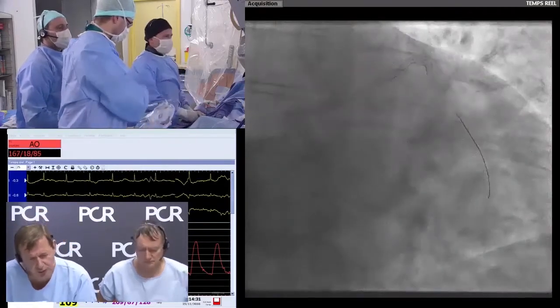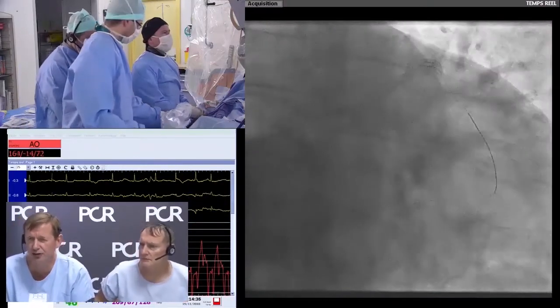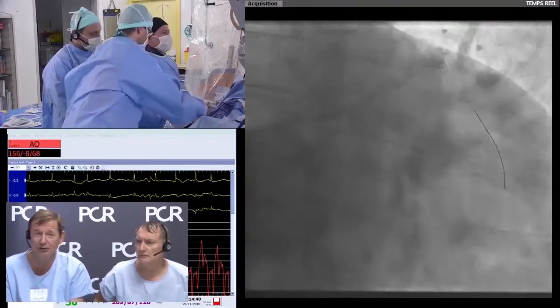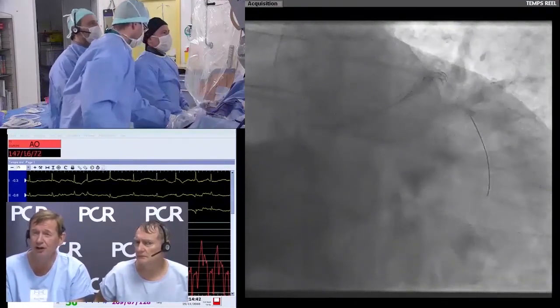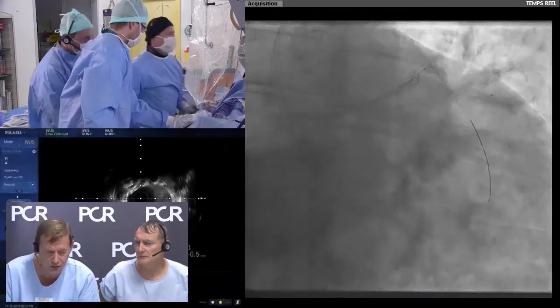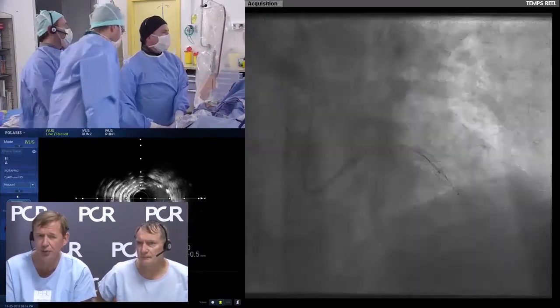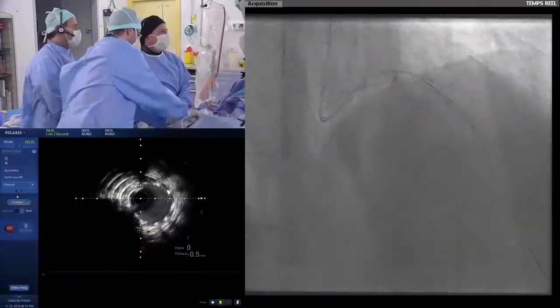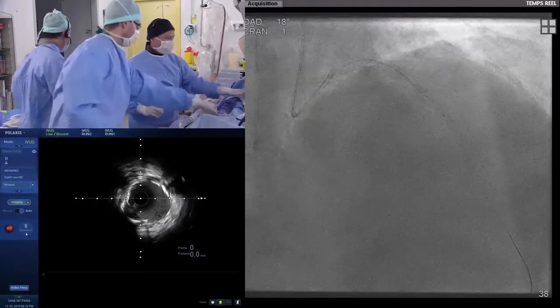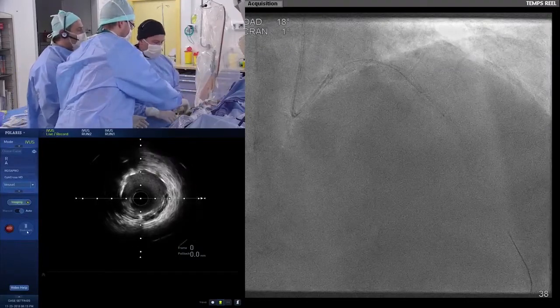We've had a question: let's say you thought you had prepared the lesion, and then you put your stent in, and in fact it turns out there's still quite marked indentation. So there's a question about what action you take if the stent didn't fully deploy in a calcified lesion because of lack of preparation. Bad luck. Yeah, that's bad luck, of course, but it's a bad luck that we could always anticipate, by doing adequate plaque modification.